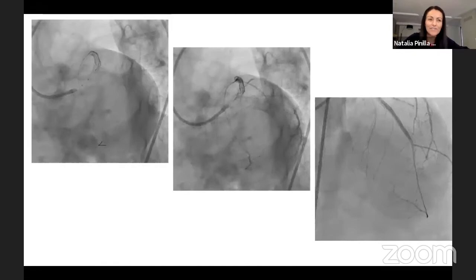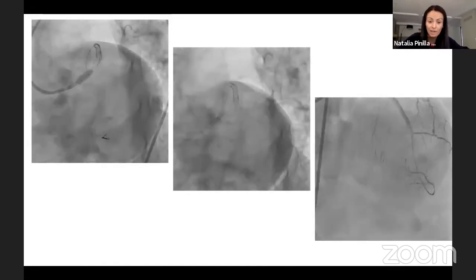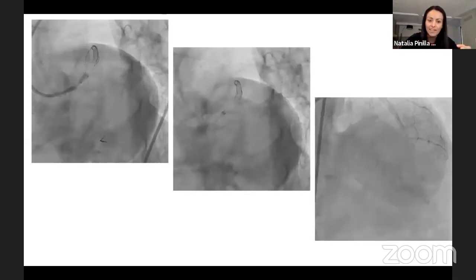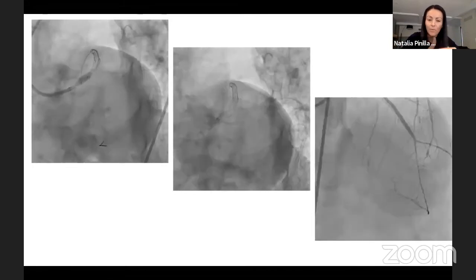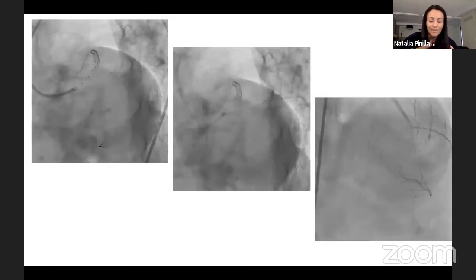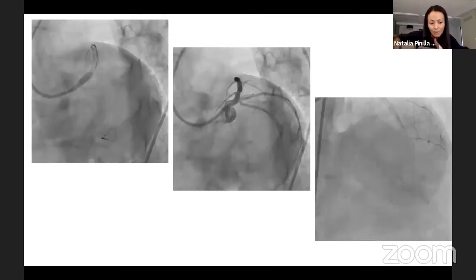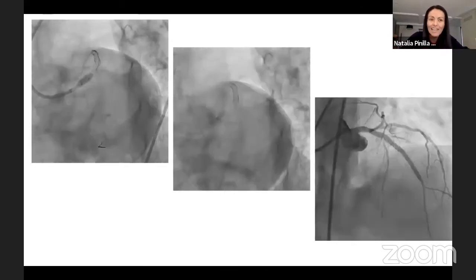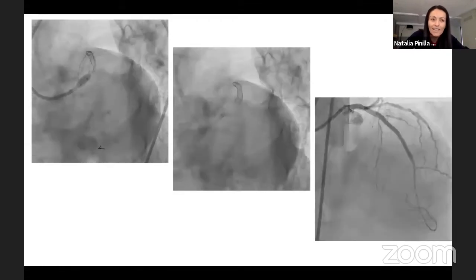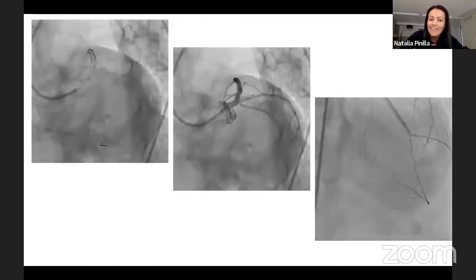Yeah, thank you for that question, because in my experience, if you have a big side branch such as this ramus, and then the vessel tapers naturally, so if you size your POT balloon well and you do a good POT, in your post PCI you almost see how those struts are beautifully displaced into the abluminal side branch. And in those cases, the final kissing is not required. Some people, every time they do provisional, aim to always do kissing. And I think it's not necessary.